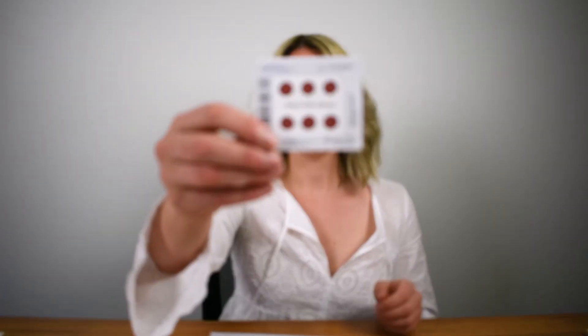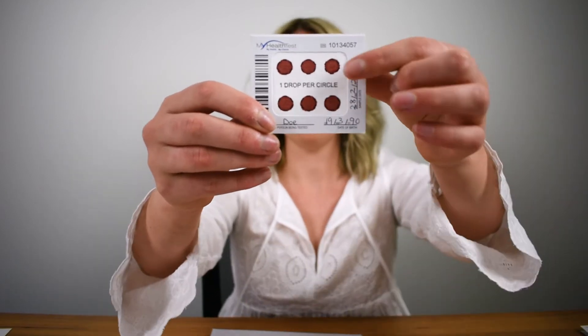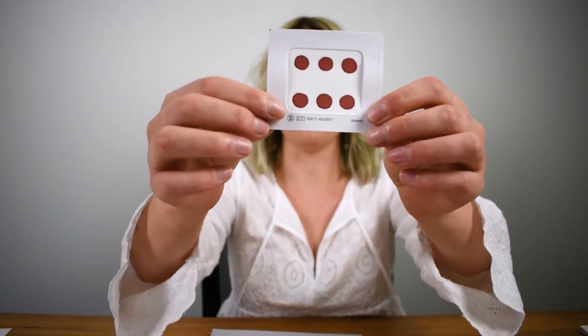My Health Test dried blood spot test is probably a little bit different to the other types of finger prick tests you might have done previously, such as a daily blood glucose measurement. The main difference is the size and consistency of the blood drop that we're looking for. What we're after is a single blood drop that fills the circle, and if you turn that card over you can see that it's bled consistently through to the back as well.